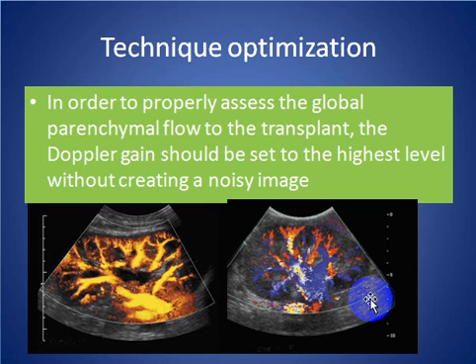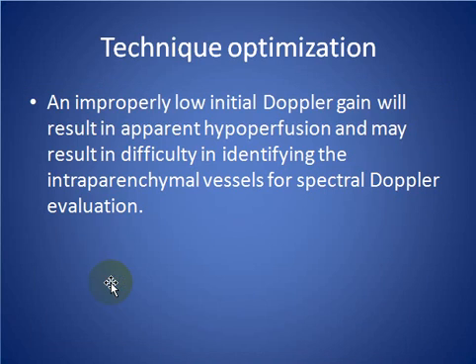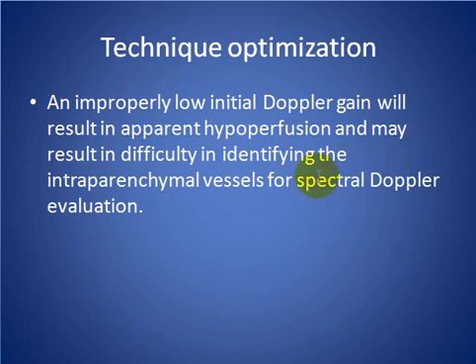Here we see the Doppler flow and perfusion of the transplanted kidney. An inappropriately low initial Doppler gain will result in apparent hypoperfusion and may result in difficulty identifying the intraparenchymal vessels.